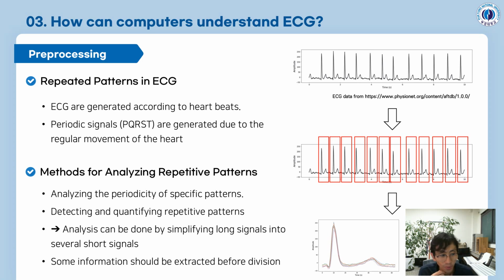Okay, right. These days, we just say, oh, I can use deep learning. Yes, right. It is true. But let me say some details. So this is the ECG signal. I downloaded data from this website and then plotted the ECG. You can see the signal of PQRST here, and it is repeated.